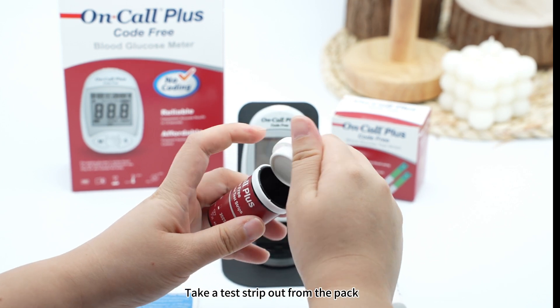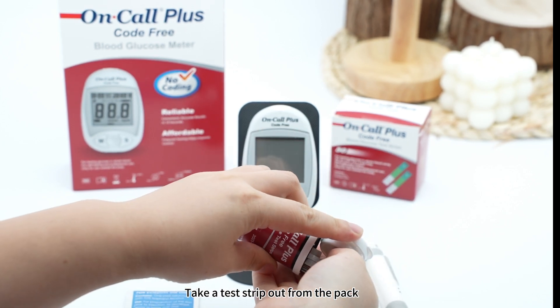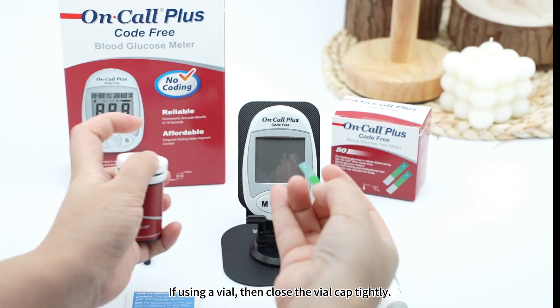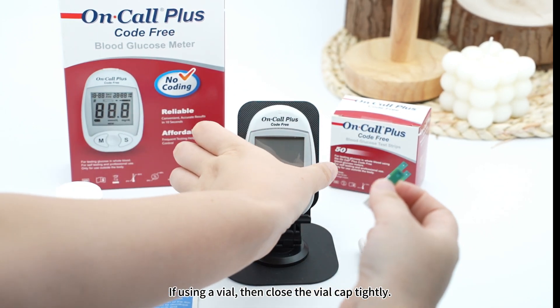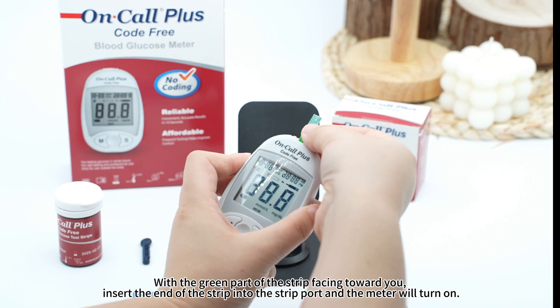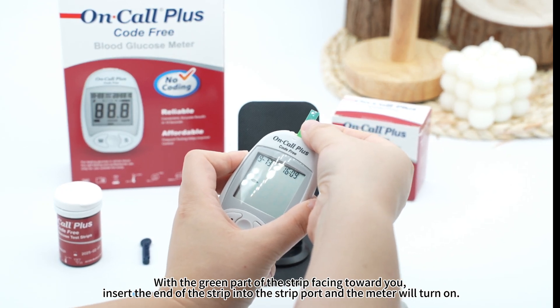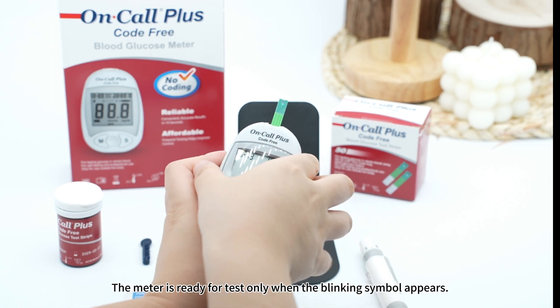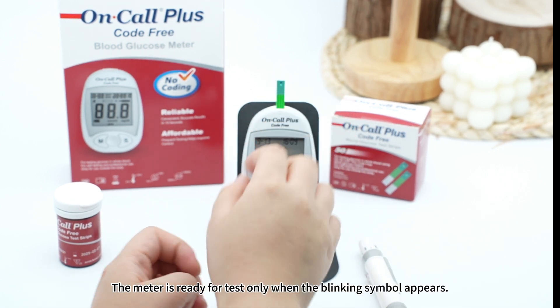Take a test strip out from the pack. If using a vial, close the vial cap tightly. With the green part of the strip facing toward you, insert the end of the strip into the strip port, and the meter will turn on. The meter is ready for test only when the blinking symbol appears.